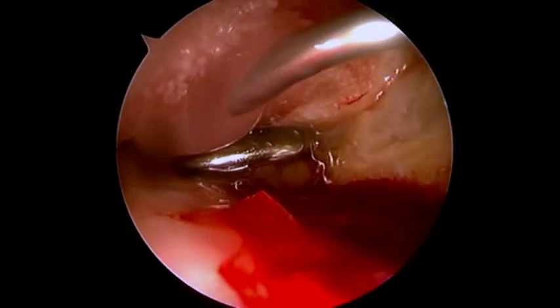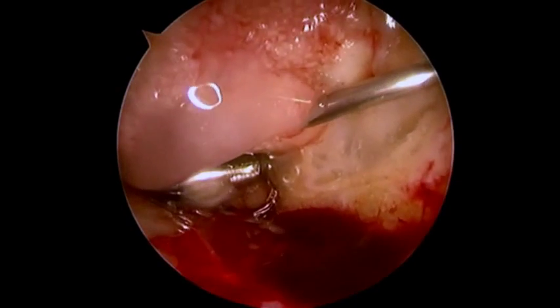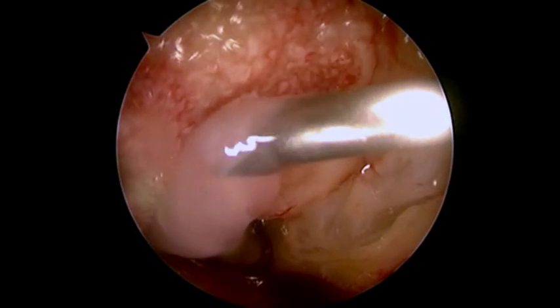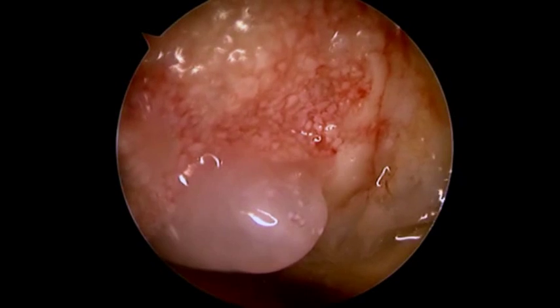Finally, the fibrin is added over the BioCartilage. The fibrin should also be evenly distributed. And as you can see, the fibrin has a nice viscosity that sticks to the underlying BioCartilage, even regardless of gravity.